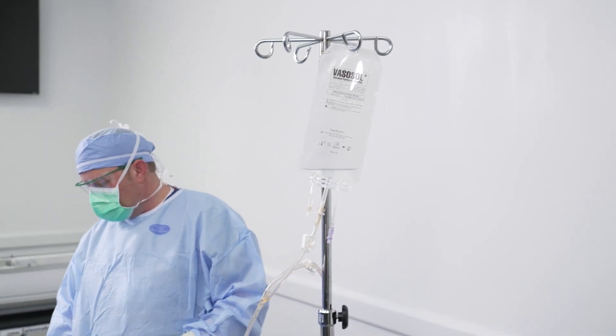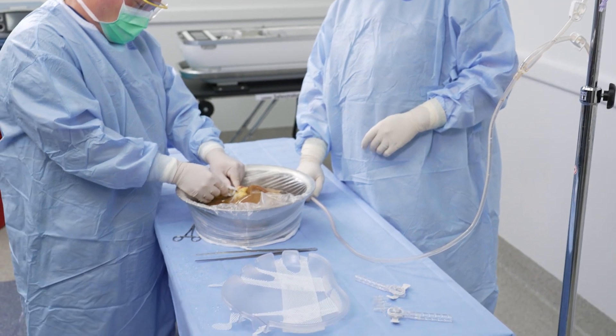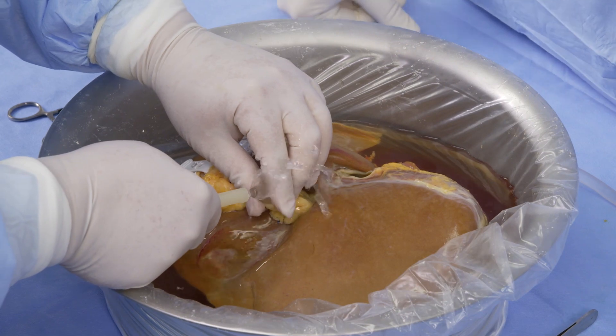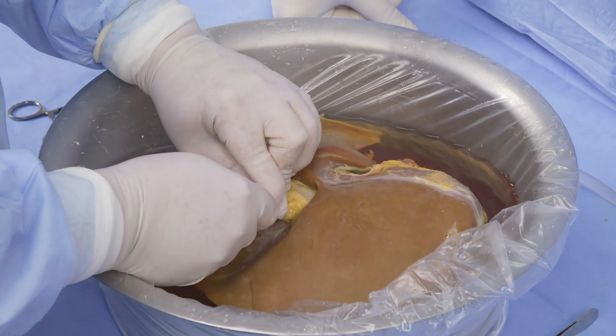Once liver cannulation is complete, perform a bag table flush using vasosol. This allows the previously used flush or storage preservation fluid to be removed from the liver, ensuring only vasosol will circulate within the liver transporter perfusion circuit.